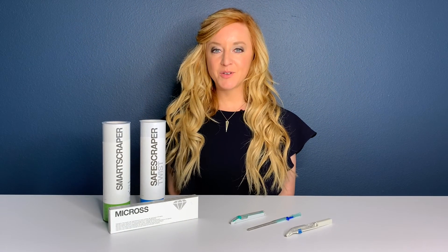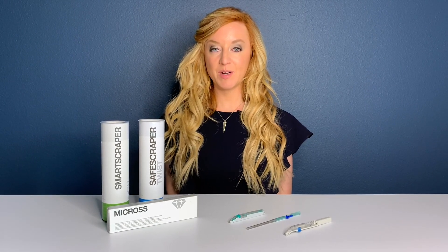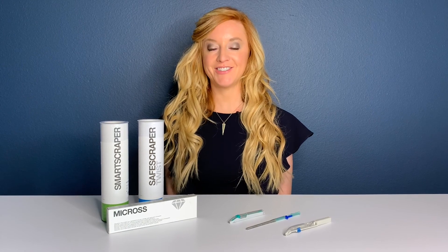All of our bone scrapers are disposable. The Micross is sold individually, and the Smart Scraper and the Safe Scraper are sold in packages of three.